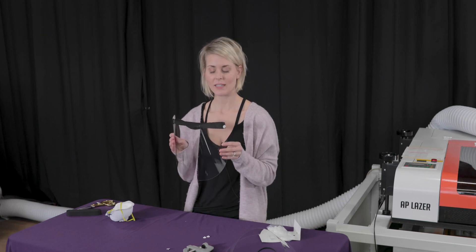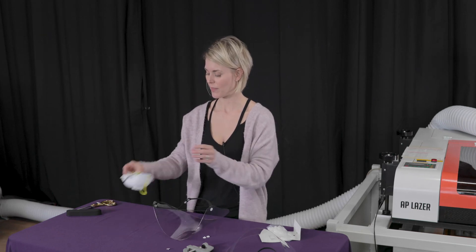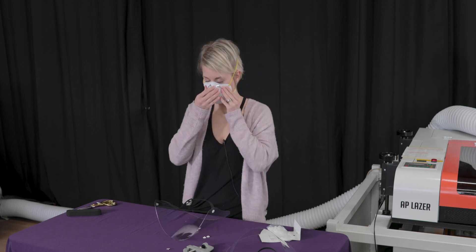And now the mask is complete. These masks are designed in such a way that when you put them on, there's plenty of room for other medical equipment like a mask.